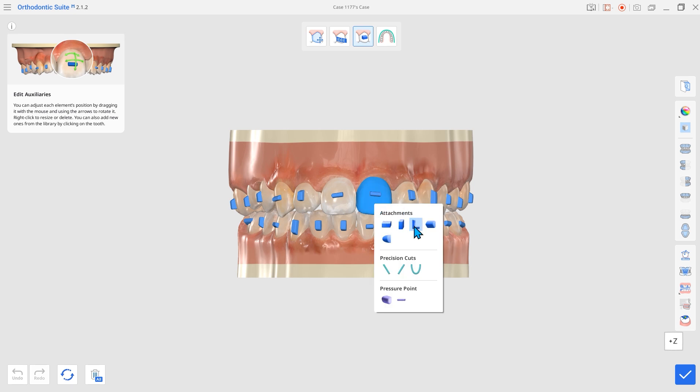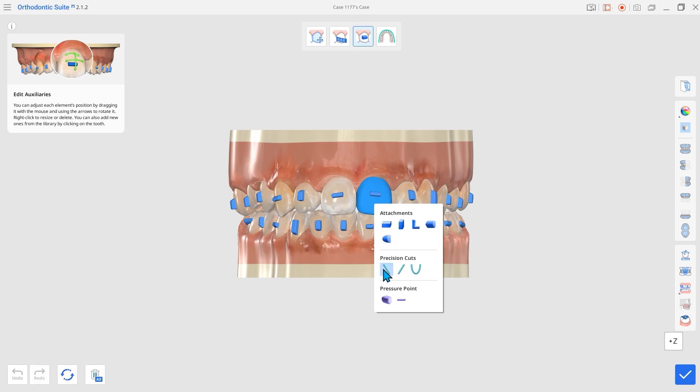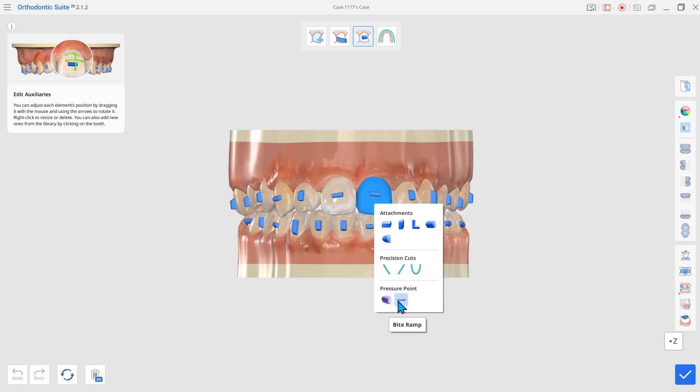Attachments now features pyramidal and elliptical. Elastic hook and button cutouts have been added under precision cuts, and pressure point now includes bite ramp and torque bridge buttons.